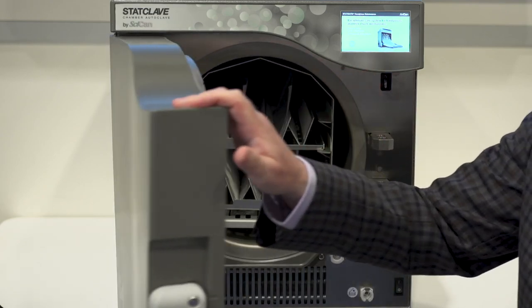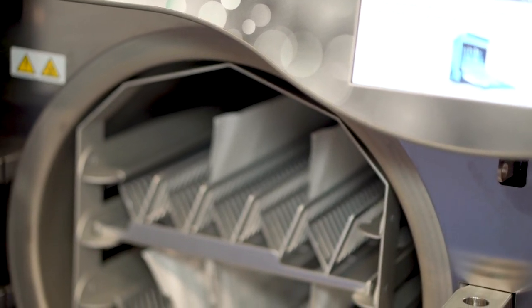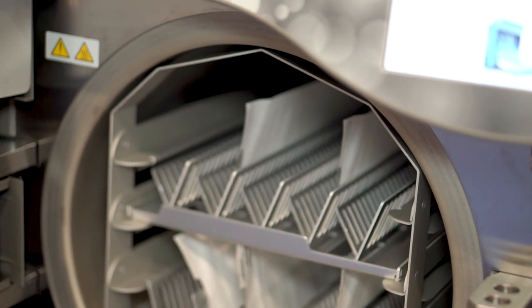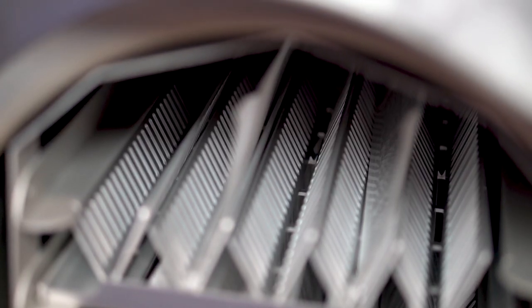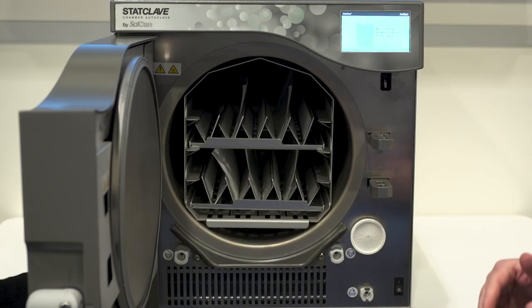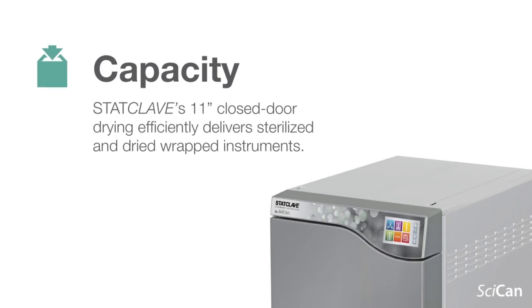Internally, we have a large 11-inch chamber, so a lot of capacity. It comes with a lot of furniture. Here you can see racks for pouched instruments. It comes with dividers to do cassettes, and also mesh trays to do just laid out loose instruments. With an 11-inch chamber, we can get a lot of capacity in there.